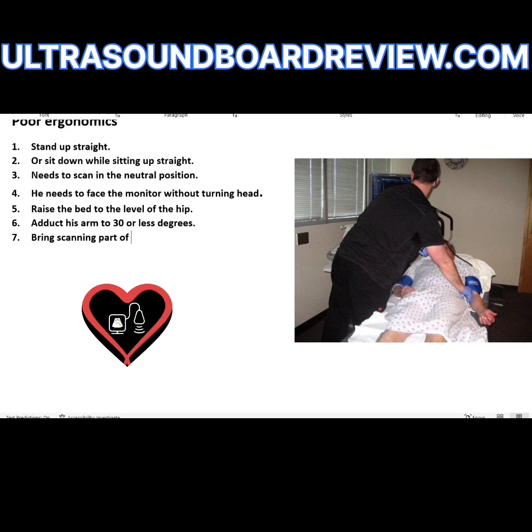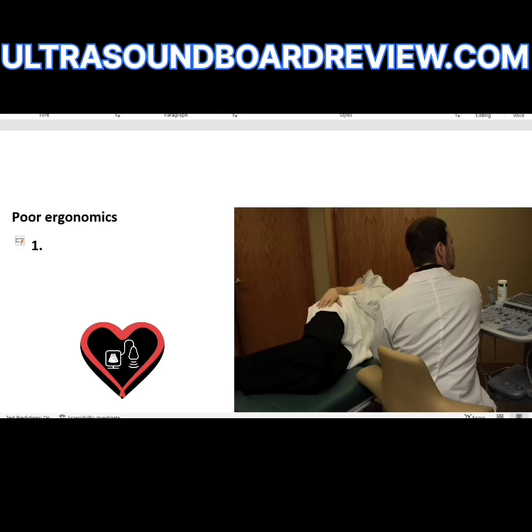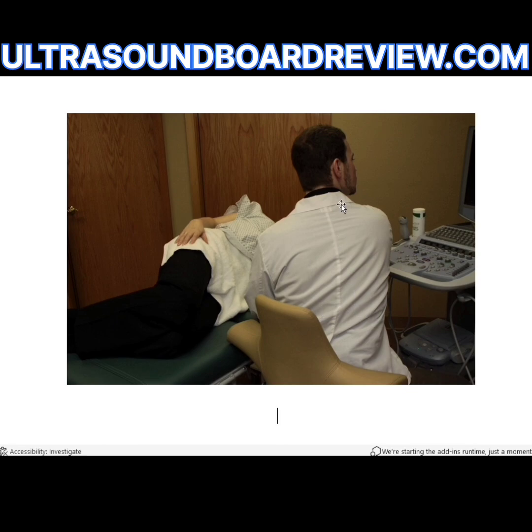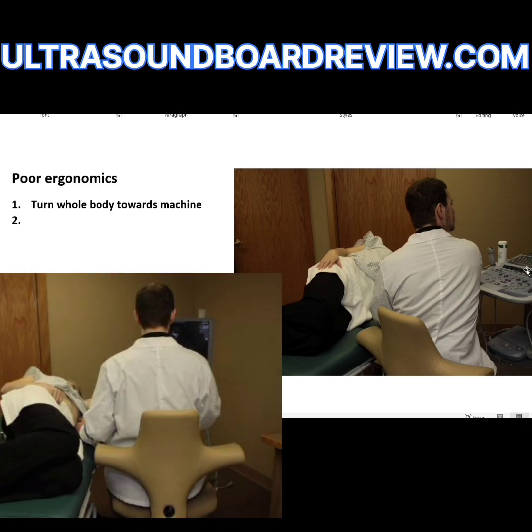Bring the scanning part of the body closer to the sonographer. He needs to not lean over the patient — you should never lean over the patient. The first thing to fix is to sit up straight and turn his whole body towards the monitor. His lower back is corked, so he needs to uncork his lower back so that his body is completely facing the machine. He could bring the patient a little bit closer and move the machine so he doesn't have to look sideways.